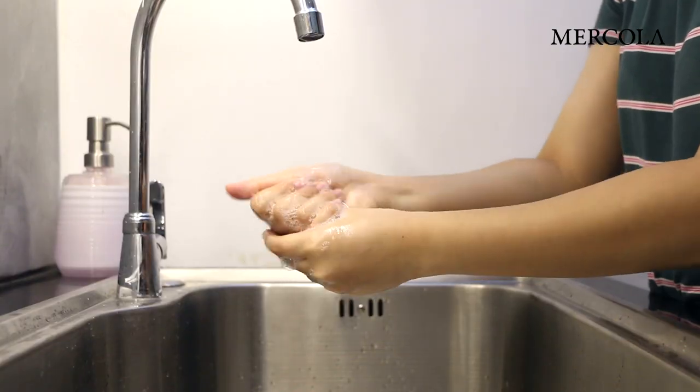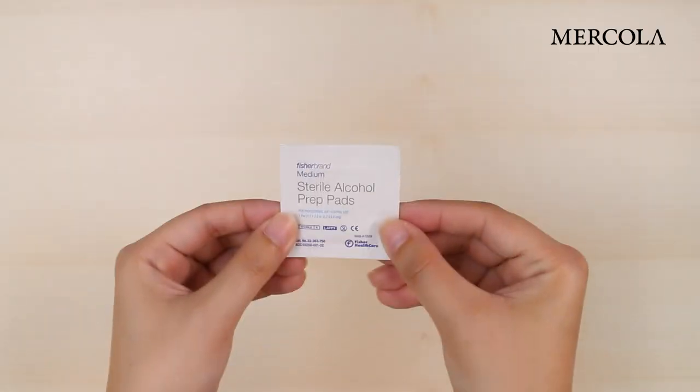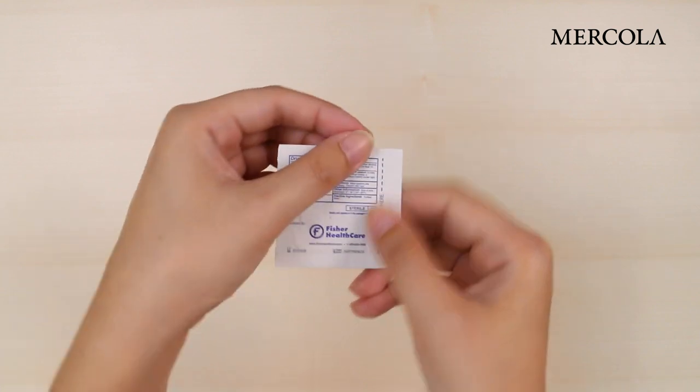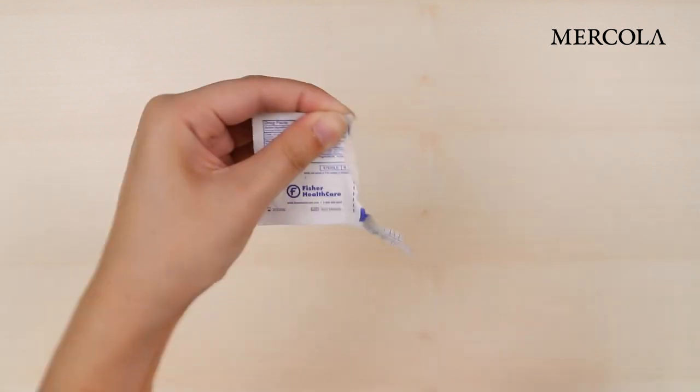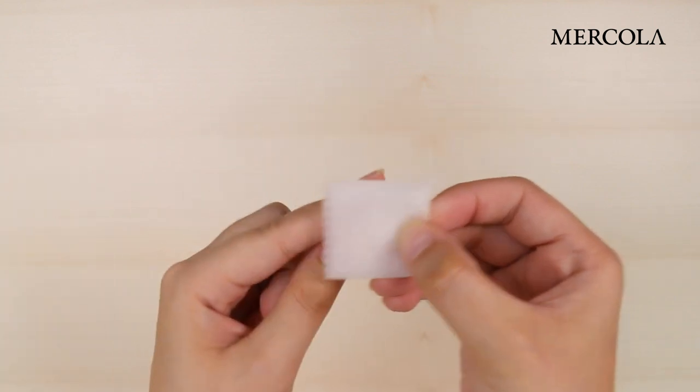Next, wash your hands thoroughly with soap and water. Once you've done that, open the alcohol pad and wipe the finger you will use for the blood spot. Choose the finger that is on the non-dominant hand.